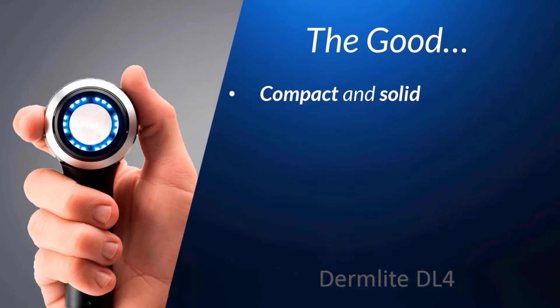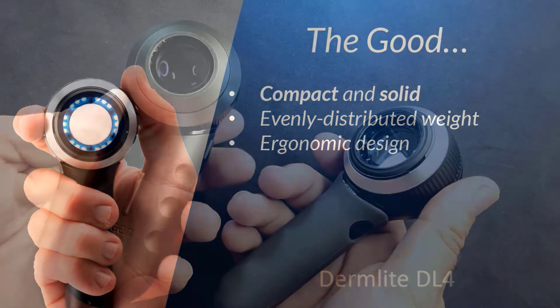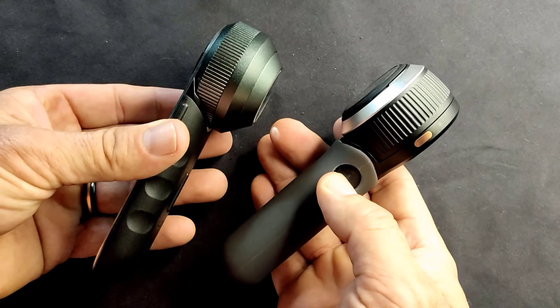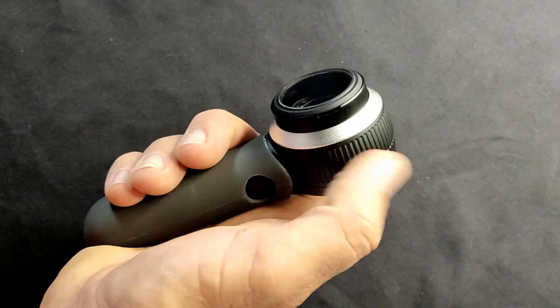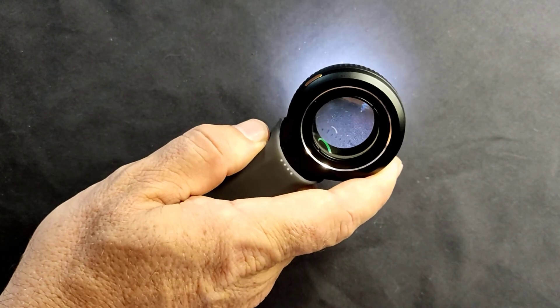Interestingly, it's actually just slightly heavier than the DL3, but its weight is distributed more evenly, and it just doesn't have that lopsided, heavier-on-one-side feeling we mentioned with the DL3. Also, its handle is more ergonomic. Just comparing the DL3 in the hand as compared to the DL4, you can see what I mean. It's easier and more comfortable to hold, and even comes with a silicone sleeve which adds to its comfort. I also find it's a bit easier to operate with one hand, again because of its weight distribution, size, and ergonomics.